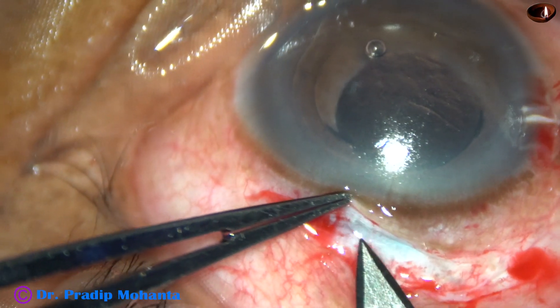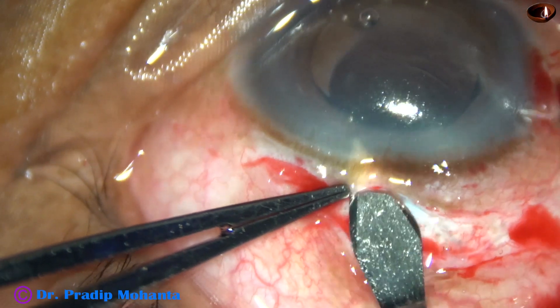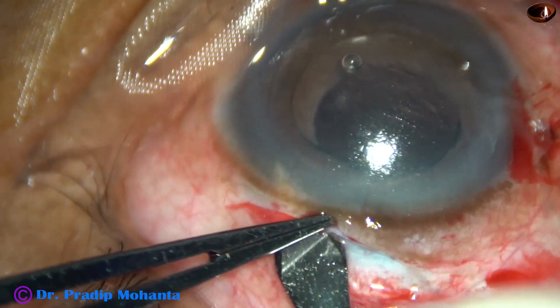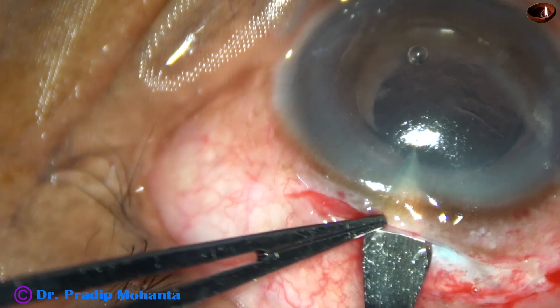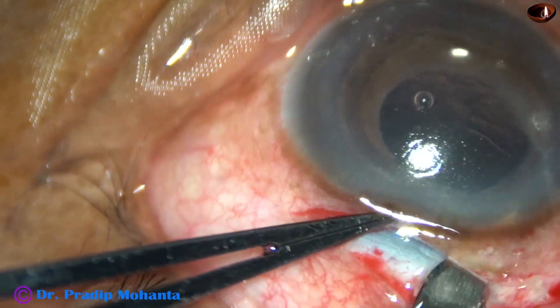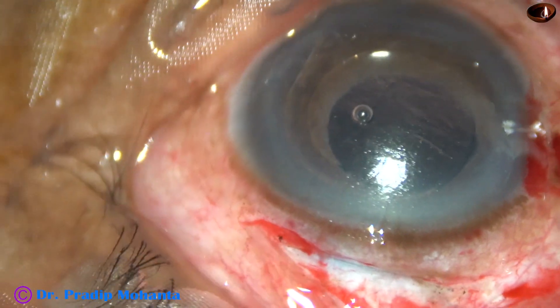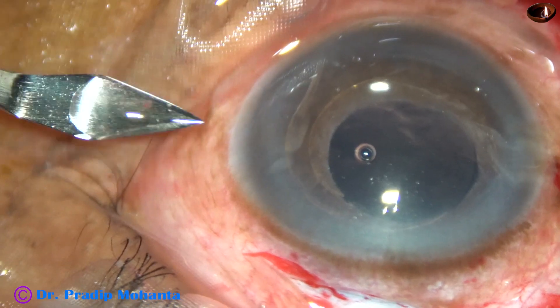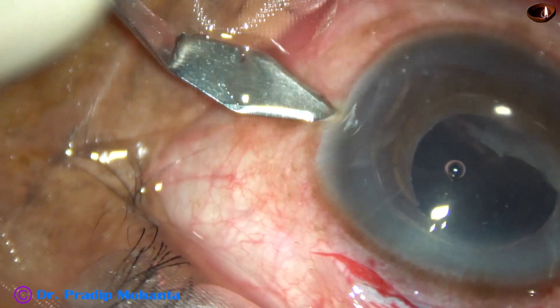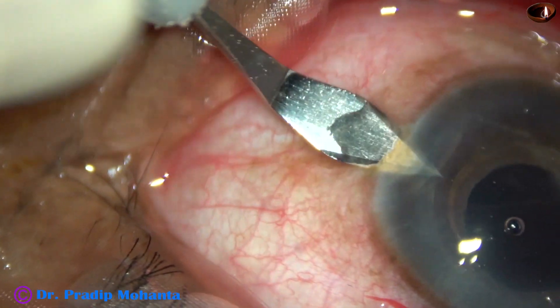And now I enter into the anterior chamber with the help of a keratome and enlarge the wound. I am going to put sutures, so I didn't make a proper sclerocorneal tunnel. And now 180 degrees away, this is another stab incision — another paracentesis wound.